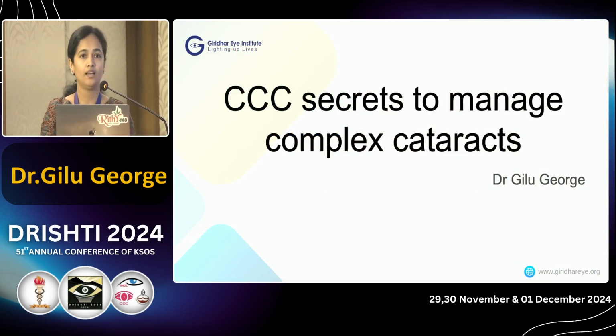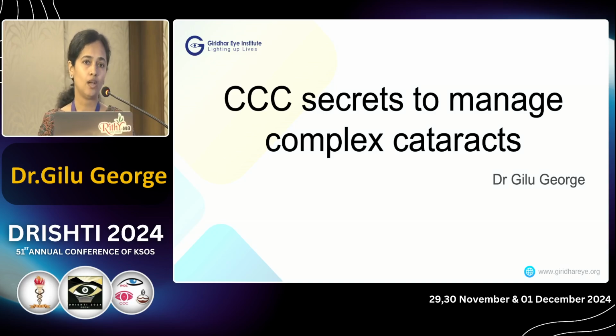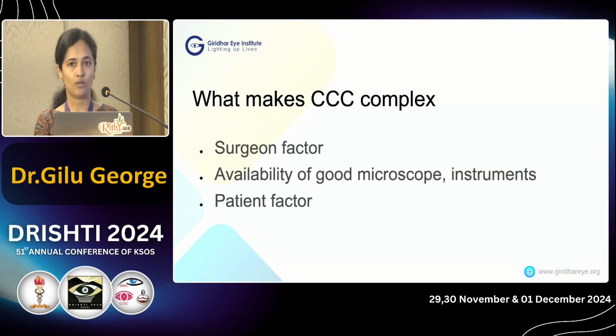Thank you. So, Dr. Kirtana has explained the pearls for a perfect capsular access in a normal routine cataract. Now, I will be dealing with the CCC secrets to manage complex cataracts, specifically in terms of complexity regarding the CCC. So, what makes your CCC complex?